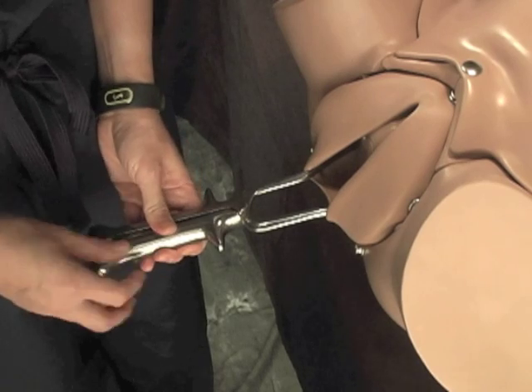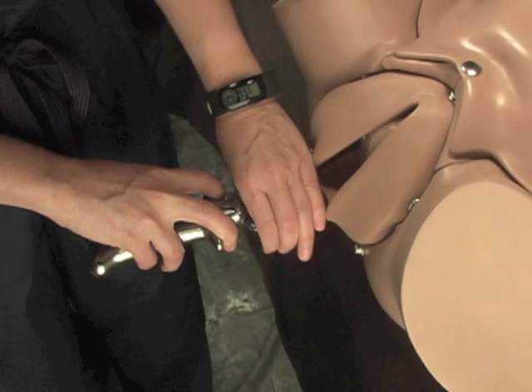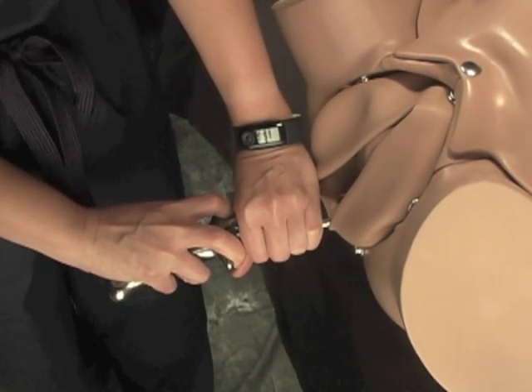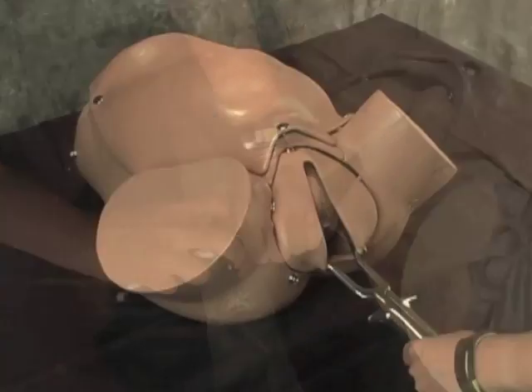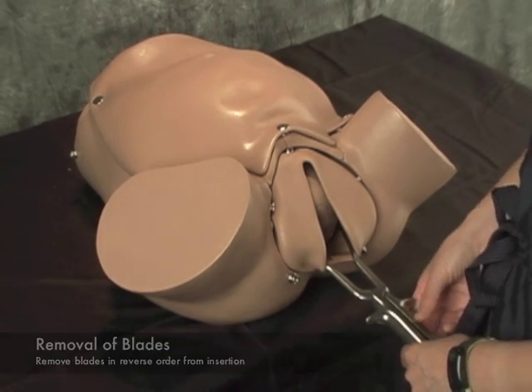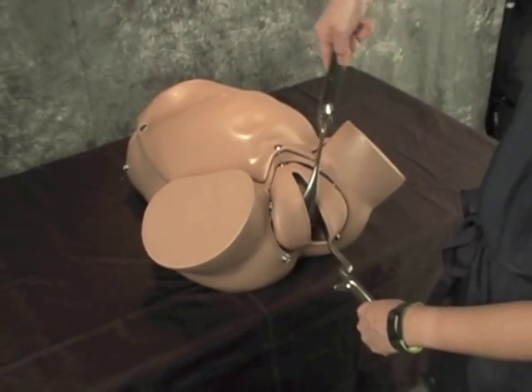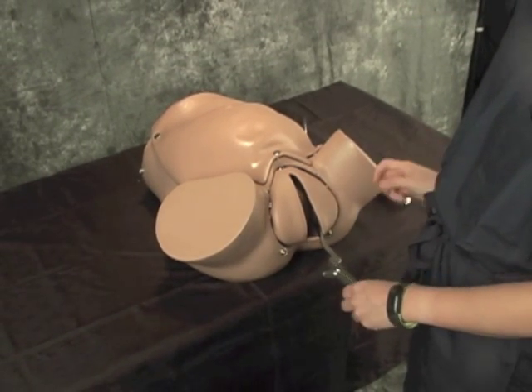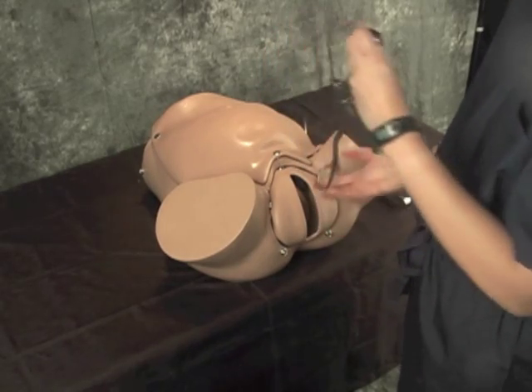Grasp the handles at the finger guards with your dominant hand while the non-dominant hand grasps the shanks. Apply downward traction using the axis traction principle. Remove the blades by reversing the order used during application — remove the right blade first. If the fetal head was in the left occiput anterior position, then remove the left blade next.